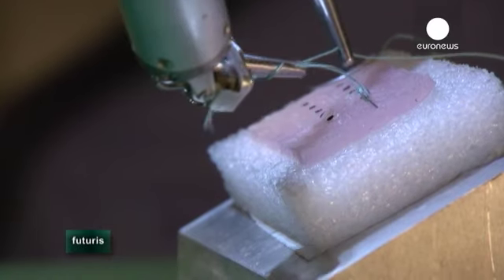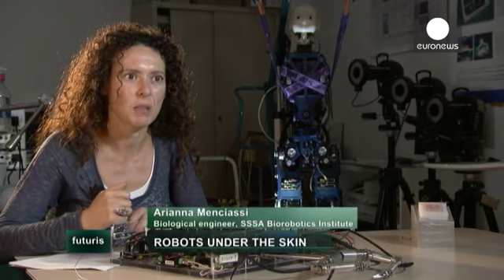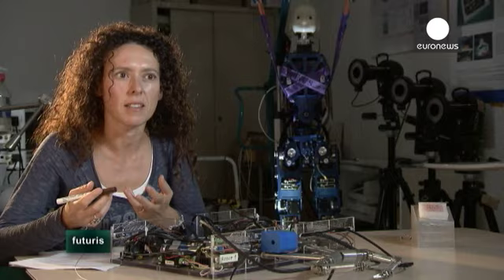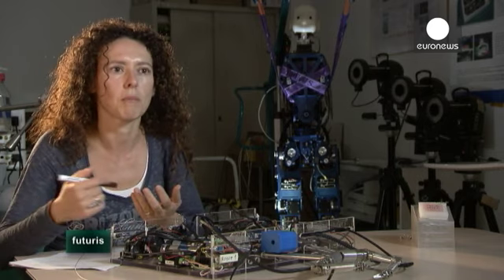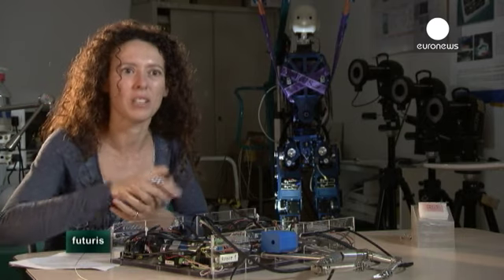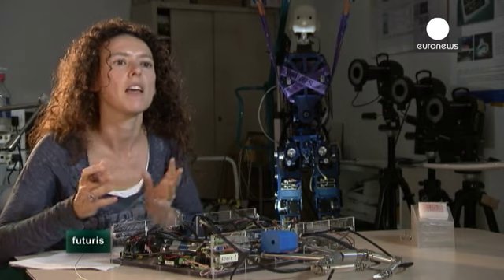Future surgical robots will be able to access human organs through smaller and smaller incisions, or even natural openings in the human body. Future robotic surgery will look a lot like what writer Isaac Asimov talked of in his book Fantastic Voyage. Some scientists are already doing research on magnetic guidance of tiny robotic capsules inside human vessels. These robotic capsules could eventually reach the most remote regions of our vascular system and could offer treatment.